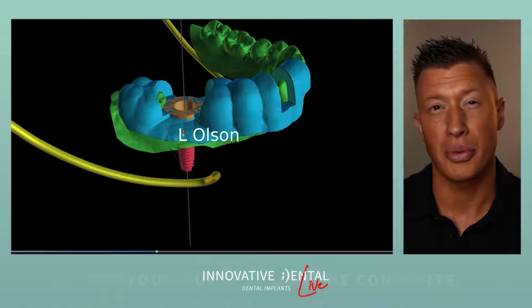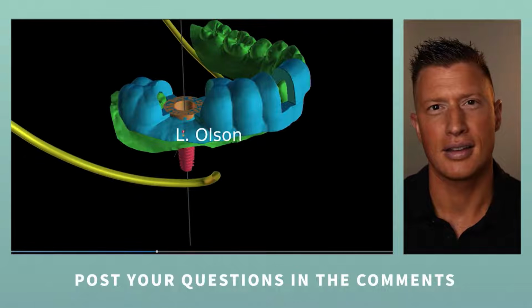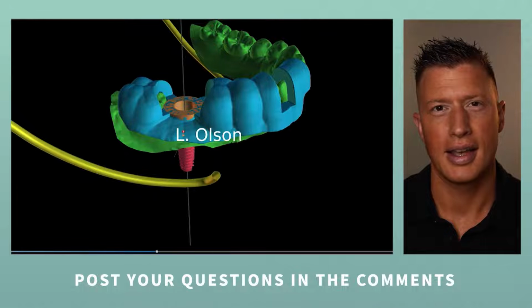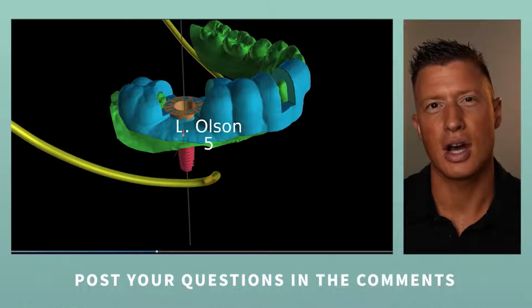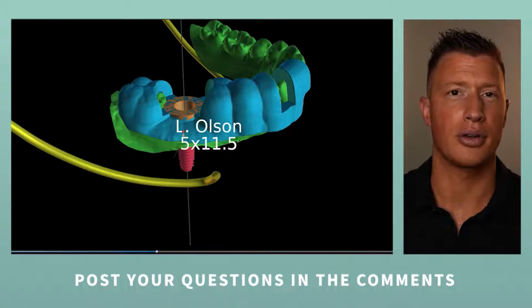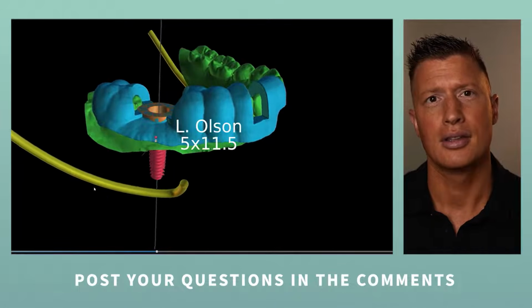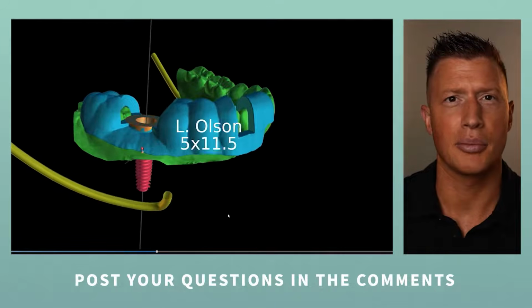We're going to put the size of the implant that's been chosen, so that way the implant's going to be accurate and fit exactly like we had planned. And then we're going to send this off to our 3D printer. 3D printing is phenomenal. It allows us to do this in about 30-45 minutes. These guides, like I said, they snap in place. They're that accurate. So we're going to place a 5 by 11.5 implant.